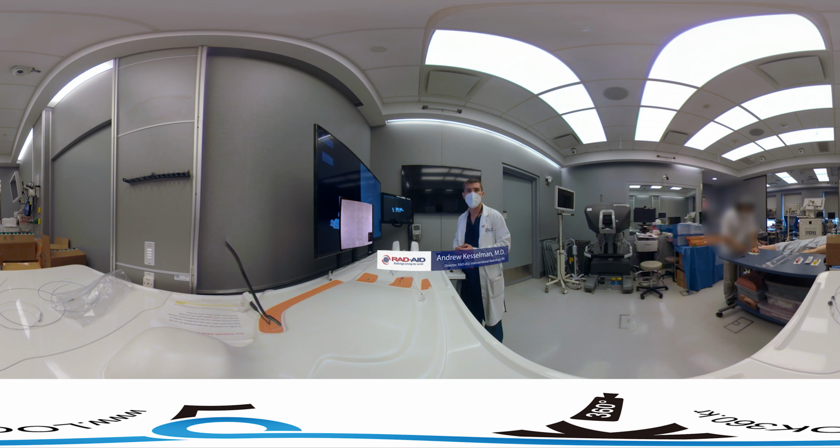So at this point, we're going to pause and we're going to switch over to microcatheter. So now we're going to introduce our microcatheter. Again, this is a smaller catheter that fits within the base catheter. This one's usually somewhere between 2 to 3 French size. This one will be a 2.4. And what we're going to use here is a micro wire, an 014 wire. It's a very thin wire, very small, with a very soft tip. We're going to go ahead and introduce that to the microcatheter, into the base catheter.